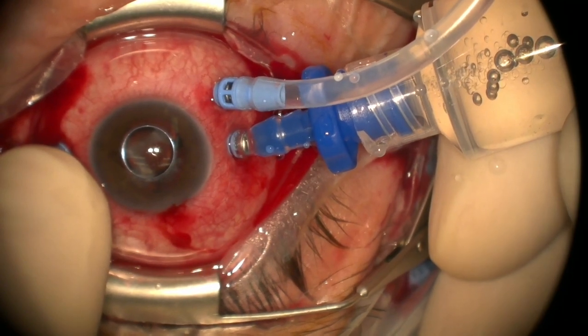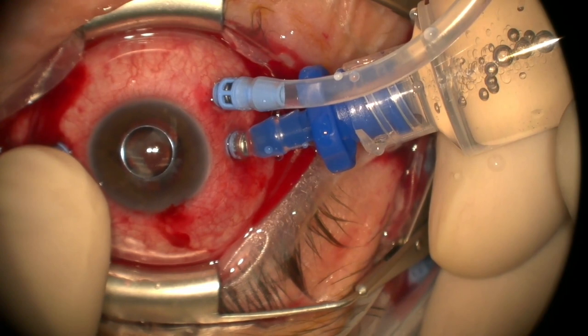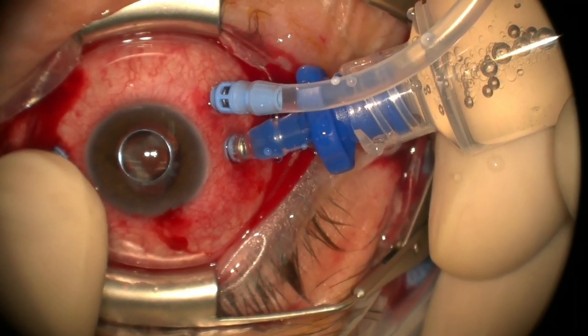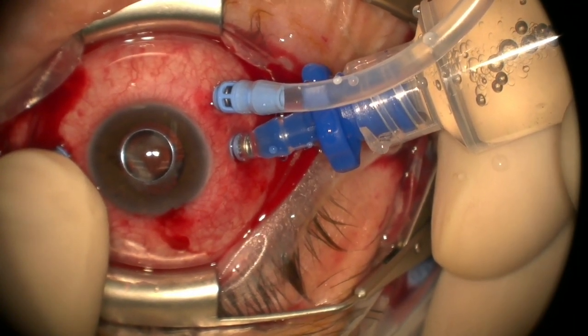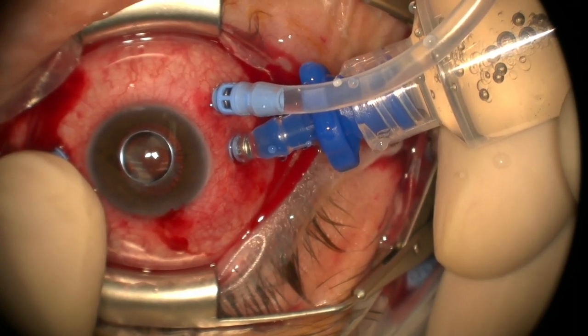And you always want to be a little careful towards the end because this device will pull fluid a lot faster than the infusion can put it in. So you don't want the eye to completely collapse and cause a choroidal hemorrhage. He's a high myope, so certainly that type of risk is higher with Eric than others.